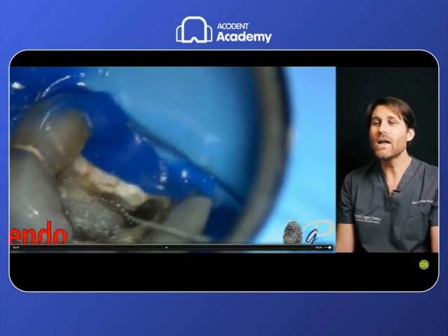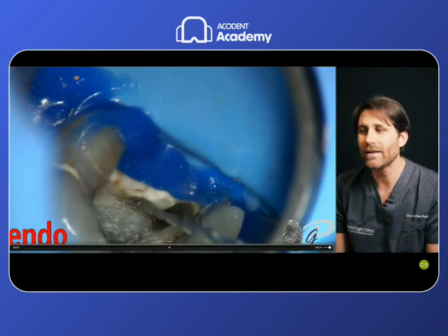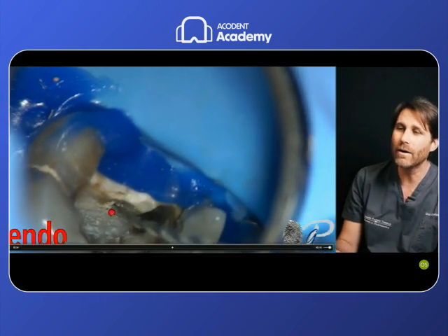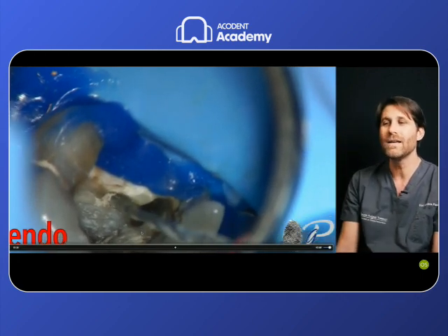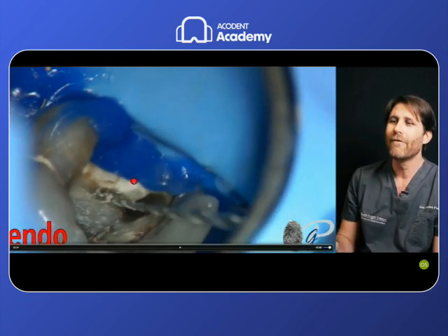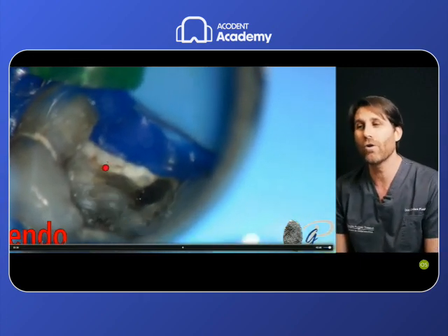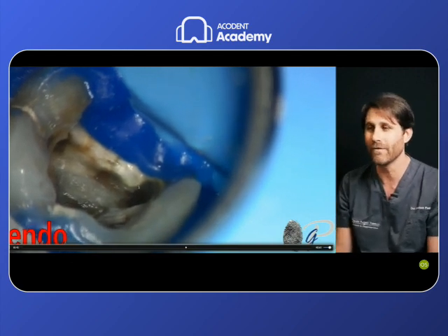But as soon as we use the correct file, as soon as we have tried different strategies, in this case the Reciproc R25M wire has the power in its tip to penetrate these 2, 3, 4 millimeters of coronal dentin that represented the coronal impediment. Look, this is penetrating with the tip, cutting, following the path of least resistance given by the root canal, removing the coronal interference, enlarging the coronal interference up to the point in which we had the difficulties.